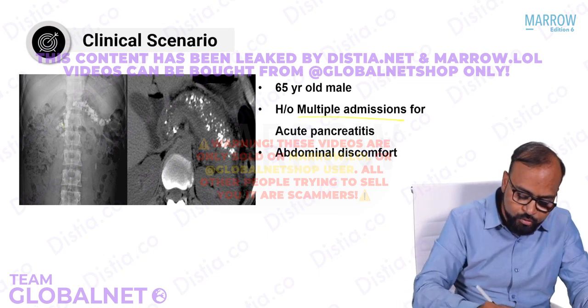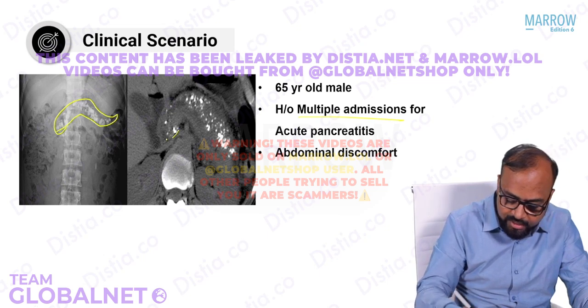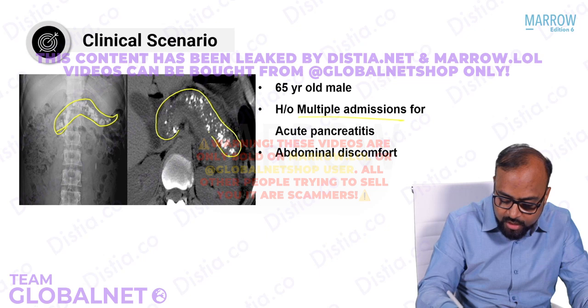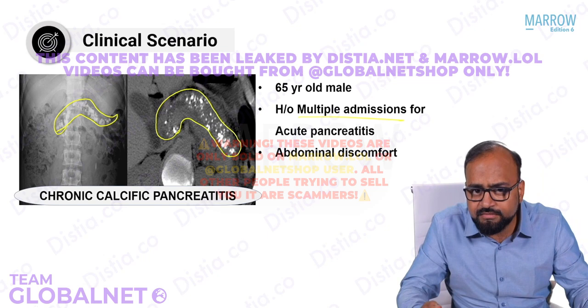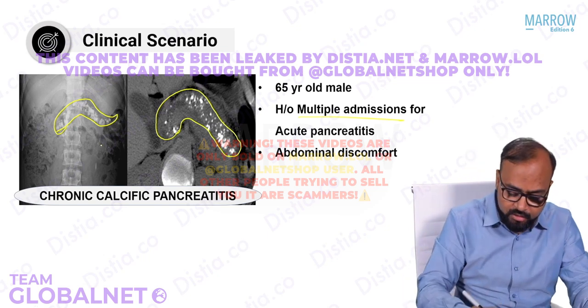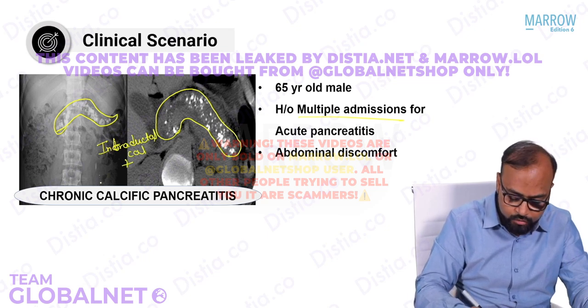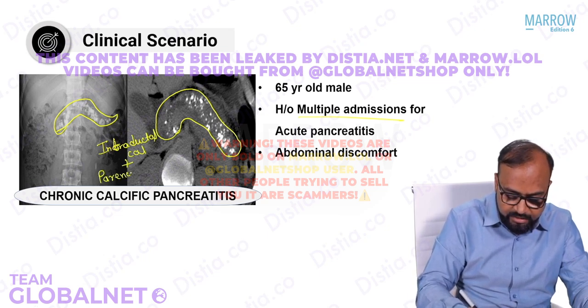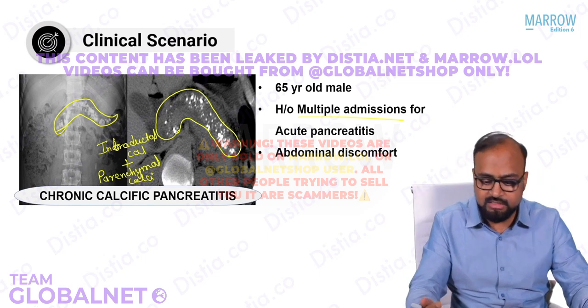There is discomfort. Look at the pancreas. Can you see these diffuse calcifications along the pancreatic parenchyma? In this case, it is now called chronic calcific pancreatitis. These calcifications that you see may be a combination of intraductal calculi within the pancreatic duct along with the pancreatic parenchymal calcifications. So it can be both intraductal calculi as well as pancreatic parenchymal calcifications.